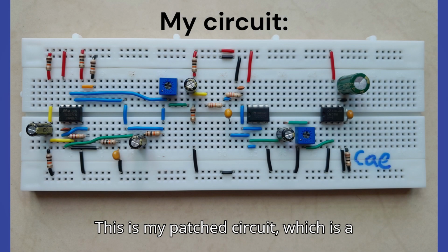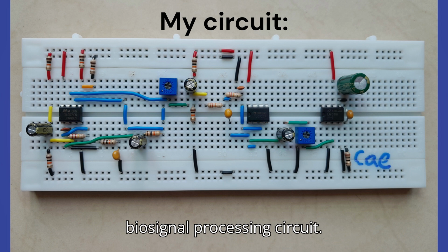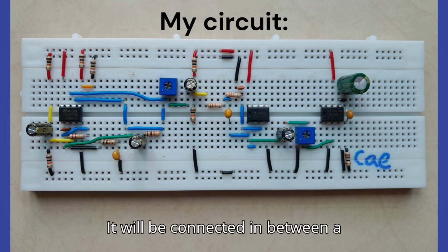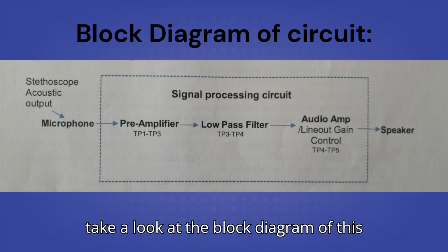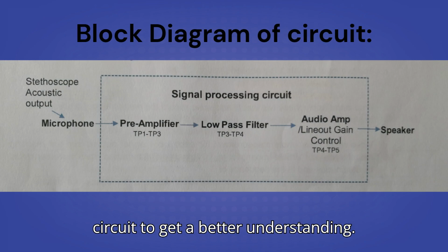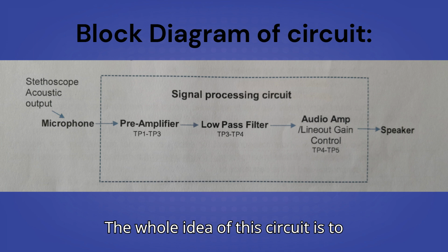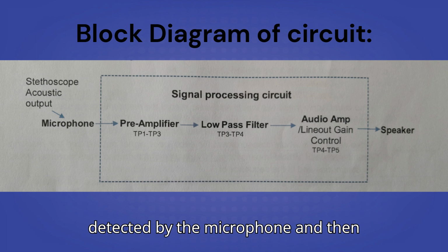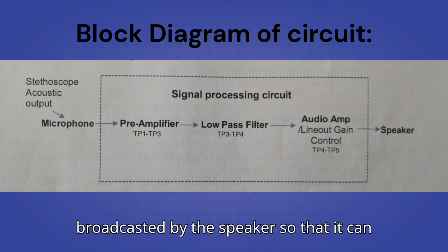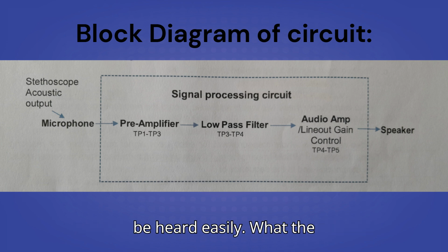This is my patch circuit, which is a biosignal processing circuit. It will be connected in between a microphone and a speaker. So let's take a look at the block diagram of this circuit to get a better understanding. The whole idea of this circuit is to allow biosignals, such as heartbeats, to be detected by the microphone and then broadcasted by the speaker so that it can be heard easily.